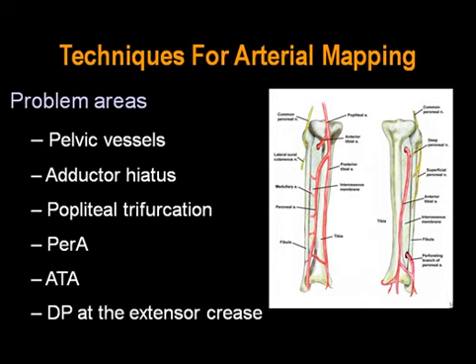There is a segment of the anterior tibial artery just beyond the origin that will not be visualized as it crosses through the interosseous membrane. In this case, you'll want to use combinations of Doppler both above at the origin and then beyond the interosseous membrane on the lateral aspect of the leg to evaluate the anterior tibial artery. Significant changes in the waveform should clue you into the possibility that there is something going on in that segment that's not visualized.